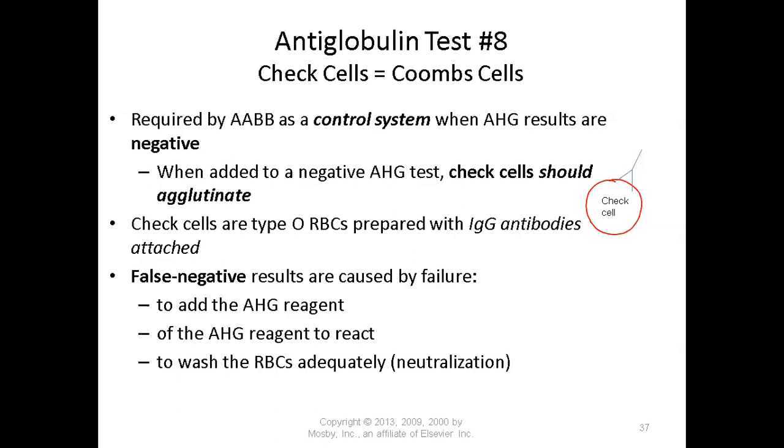Okay, because if we do not wash properly or we do not wash, our AHG reagent can be neutralized by junk that happens to be in that tube. And we're going to build on this in a moment. But for now, remember, check cells have IgG affixed to them.